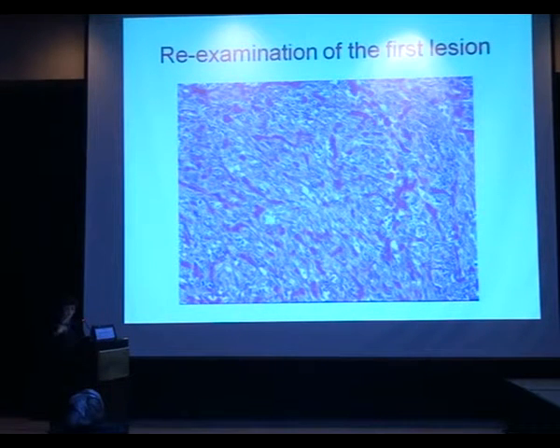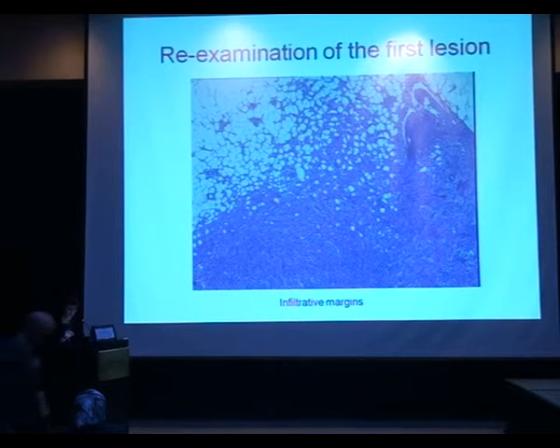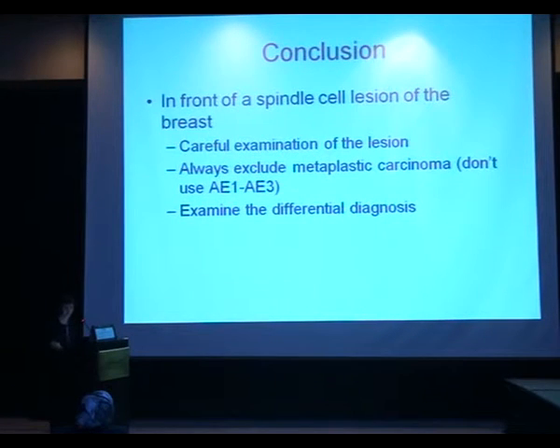So here we go back to the first lesion. We asked for the blocks of the first lesion. And also, if you look at the periphery of the first lesion, because we didn't know that, we first received a biopsy, but the patient had a surgery the first time. And in fact, if you look at the periphery of the lesion, you can see an infiltrative aspect with infiltrative margins, and also some areas on the first tumorectomy where you had a lot of atypia. But in fact, it was completely misdiagnosed, this case. It was first diagnosed in a biopsy as a PASH. In another hospital, it was diagnosed as a fibromatosis with atypia. And in fact, it's a metaplastic carcinoma.